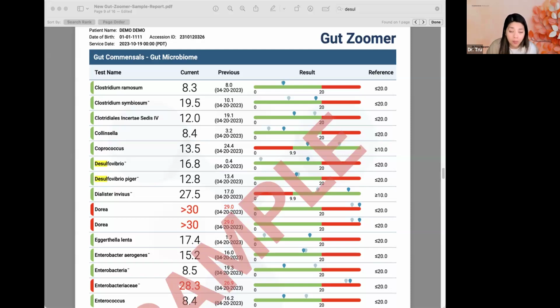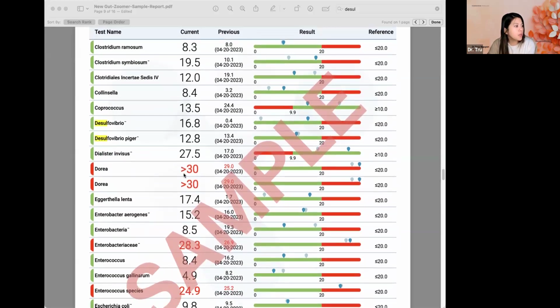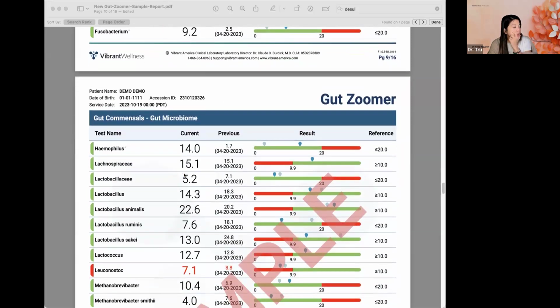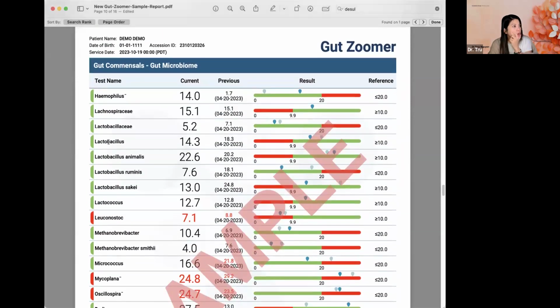So typically I have a lot of women patients who have cystitis, and when you treat the gut microbiome, the recurrent cystitis goes away, especially very complex UTIs. These are the ones that you need to pay attention to. Okay, so I'm going to go through and I'm going to show you. Actually, there's one more, lactobacillus.